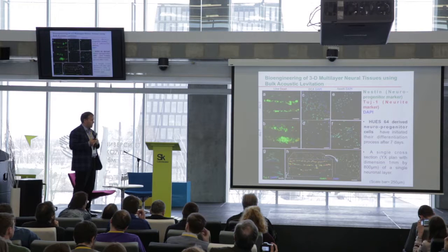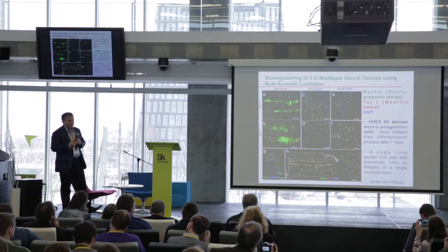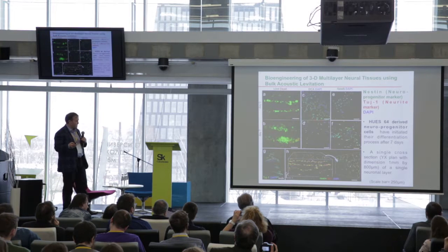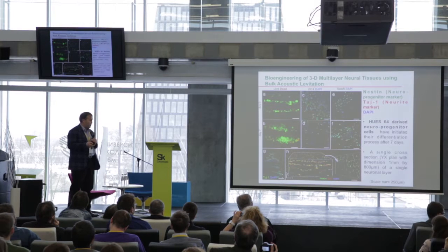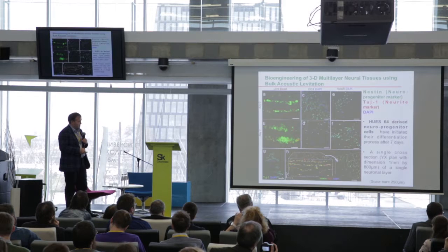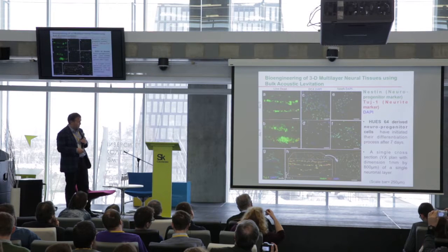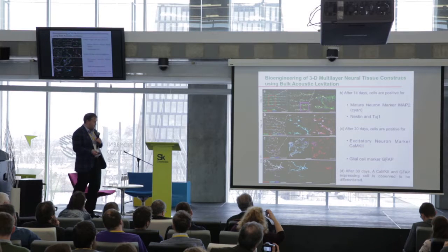We're getting interested in their electrical properties, but what we want to really show is that we actually have a neural circuit, and that's mainly functionality. So the interesting technological part, or the powerful side of this technology, is you just, with the turn of a wave, you can very well start with well-controlled layers in a gel. In this case, we use either fibrin gel, and we have worked with GelMA as well, methacrylated gelatin.